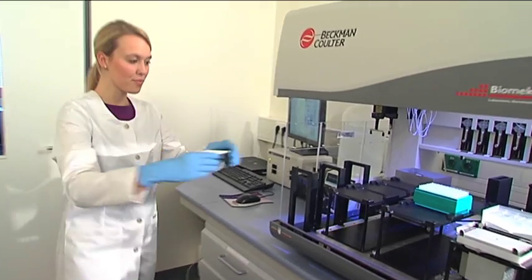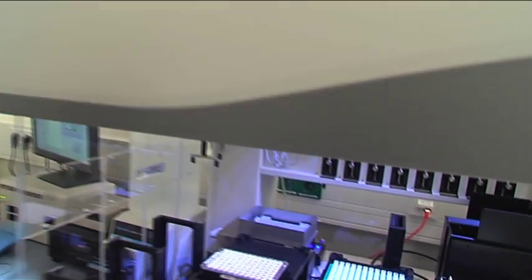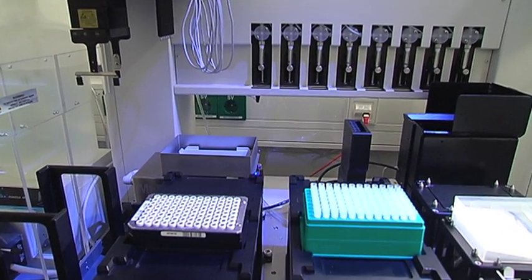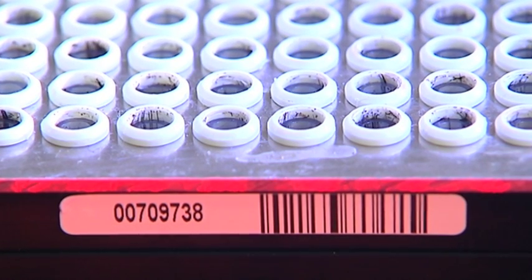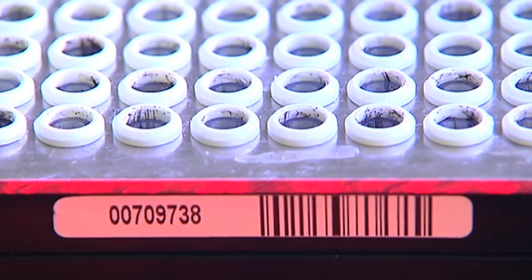The open tubes are processed in a liquid handling machine. The plate barcode ensures the reliable identification of the samples throughout the process.